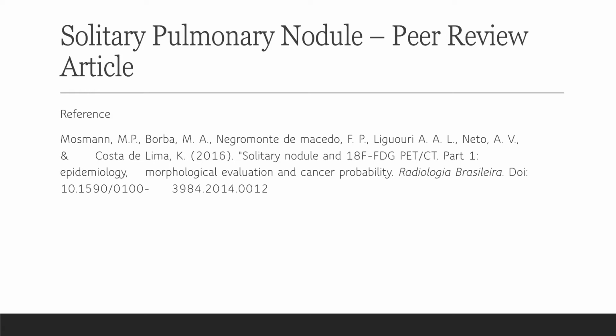Whether or not that nodule is cause for concern depends on further testing. 20% of suspicious nodules found in radiographs end up being associated with alterations mimicking solitary pulmonary nodules. Rib fractures, sclerotic bone lesions, skin lesions, electrodes, or nipples have all been reported as suspicious lesions in the past.